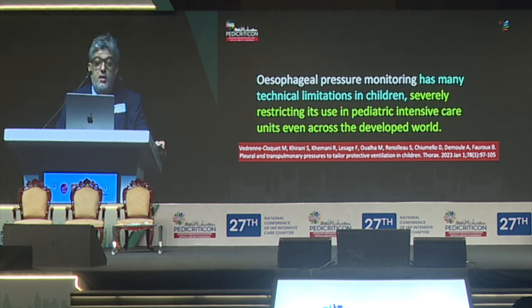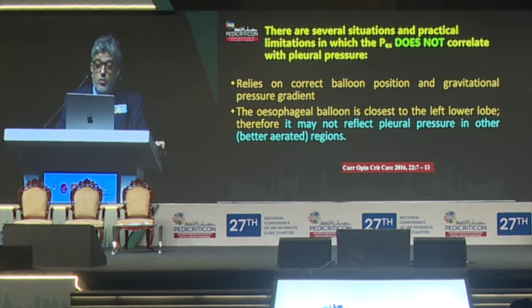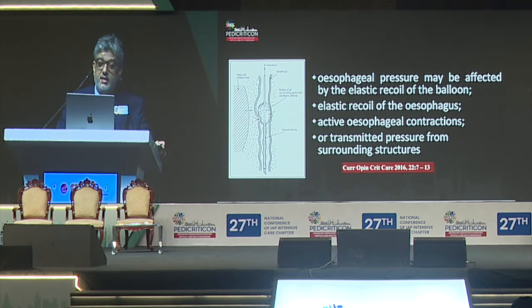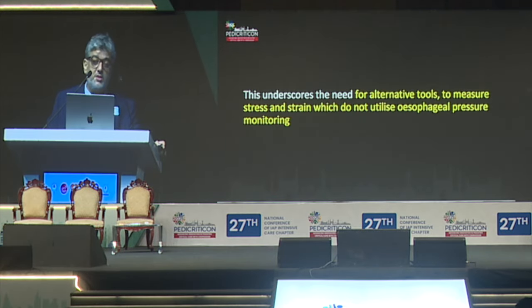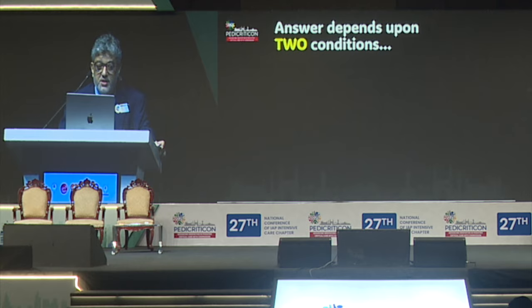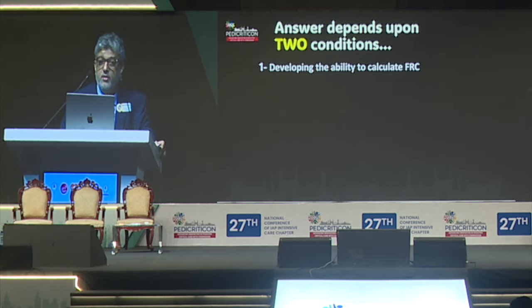But esophageal monitoring has a lot of technical limitations, even in developed countries. It relies on the correct balloon positioning, gravitational forces. It is not validated in prone positioning. It also depends upon the elastic recoil of the balloon, the esophageal peristalsis, etc. There are a lot of technical issues with esophageal pressure monitoring. And that is why it underscores that we need some alternative tools to measure stress and strain which do not use esophageal pressure monitoring. And that brings us to this question, can we do that? And the answer will depend upon two conditions. First is, you should have an ability to measure FRC.